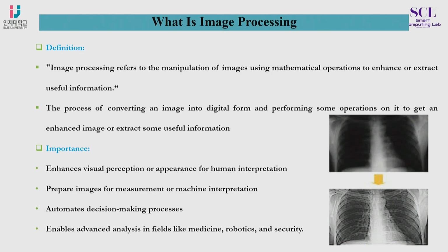For example, here you can see the ribs can be visualized while enhancing and applying different kinds of mathematical operations. So, enhance visual perception or appearance for human interpretation.